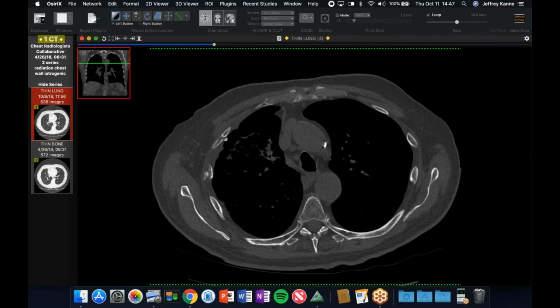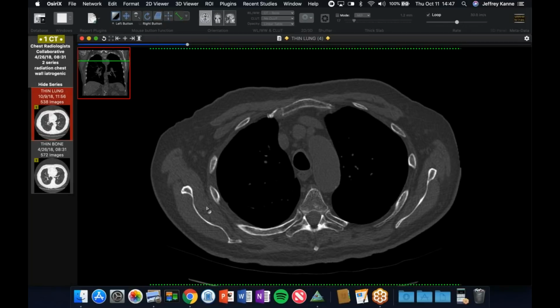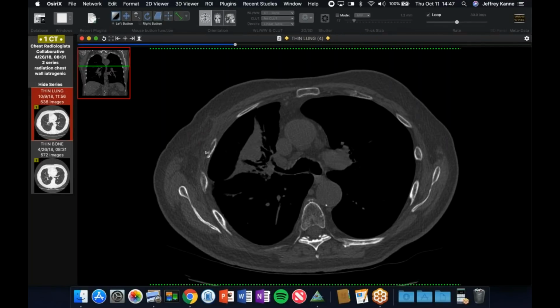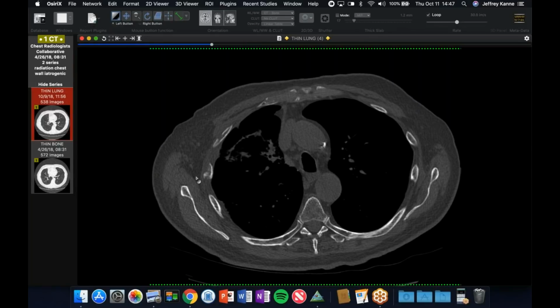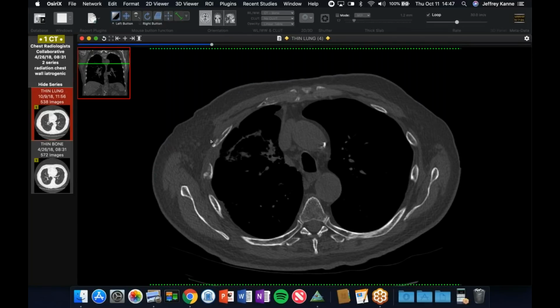And so we did a follow-up of that just as part of the routine follow-up. And you can see that now there's a pathologic fracture through a couple of these ribs, subacute, more acute there. And then you get more osteolysis out laterally on these lower ribs. And then another fracture. So these are two cases of radiation-induced osteitis, one causing exuberant callus or periosteal new bone, in this case causing osteolysis and pathologic fractures. Now, the risk factors, of course, are dose and how much of the chest wall is involved, but also more peripheral tumors tend to be closer to the chest wall, so they're more likely to get a higher dose to the ribs.